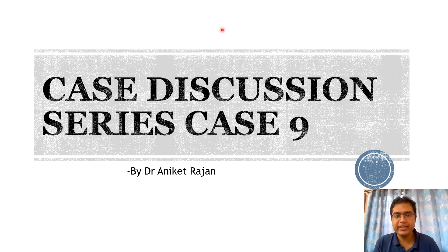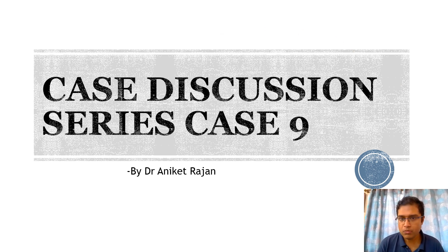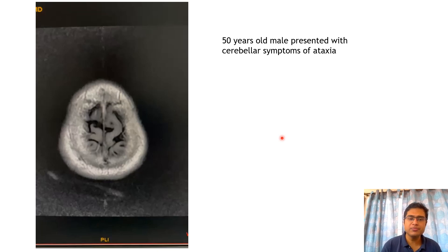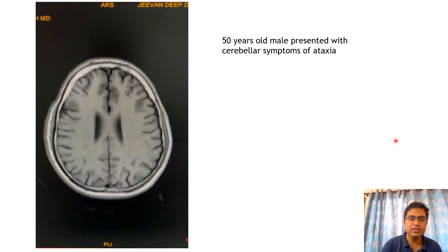Hello everyone and welcome to case 9 of this case discussion series. Today we will be discussing a case that I recently encountered — it was a bit complex. We have a 50-year-old male who presented with cerebellar symptoms of ataxia, and the history was not very clear. This is the MRI brain of that patient — the axial T1-weighted images.